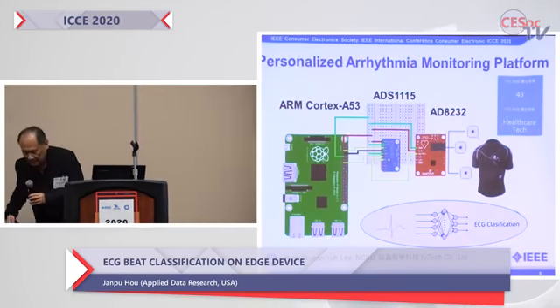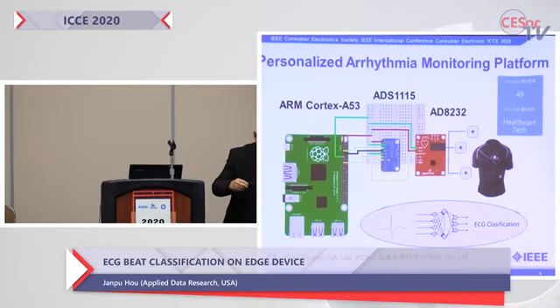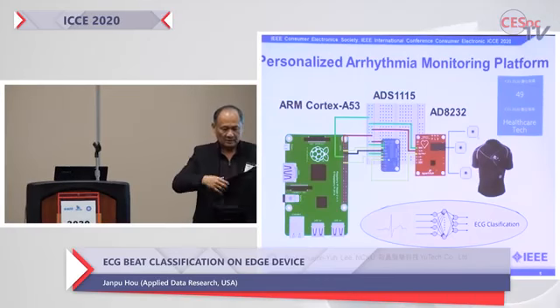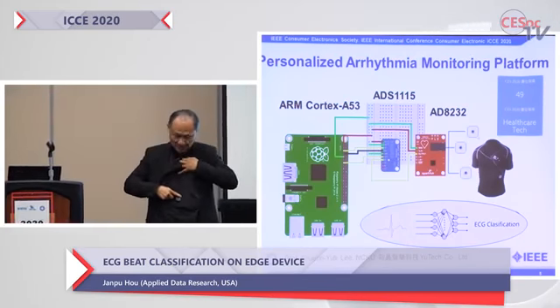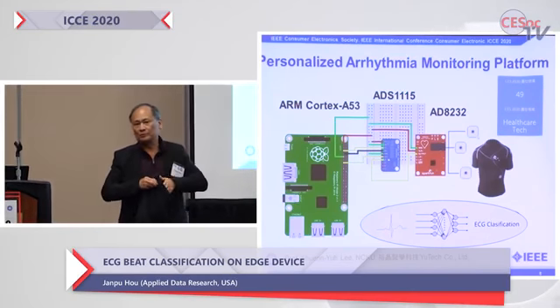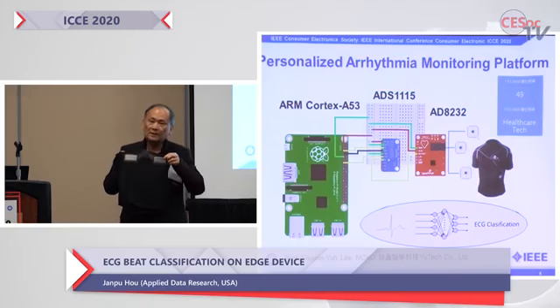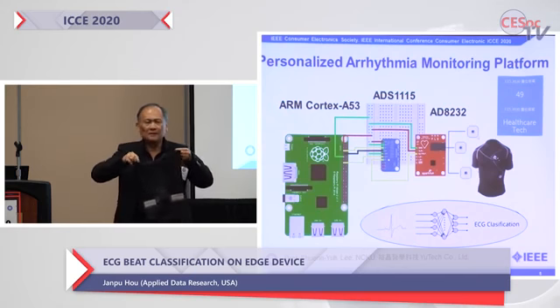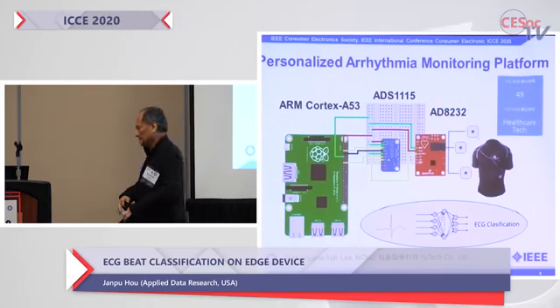And here is another one. Device. Okay, that's the on-device training. That's where we want to put our model. And then inside is the lead. And there's plenty of these. You can get them from Amazon. That's where I got it from.